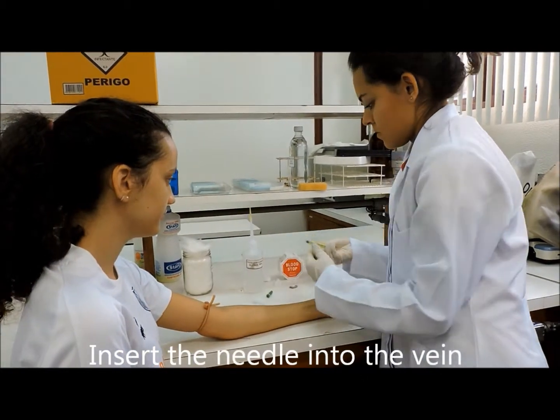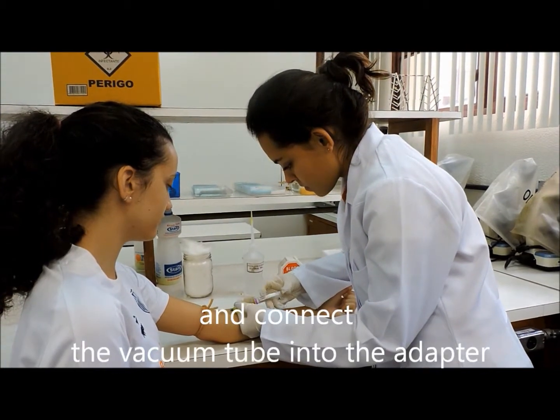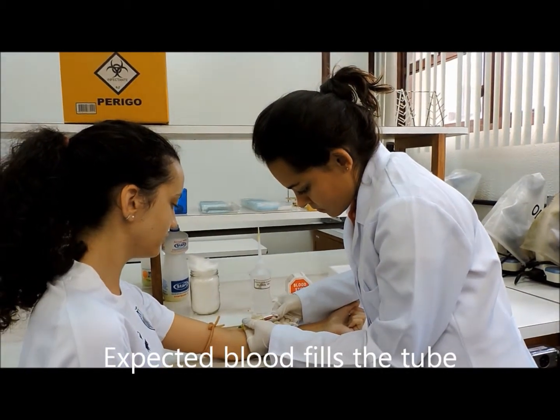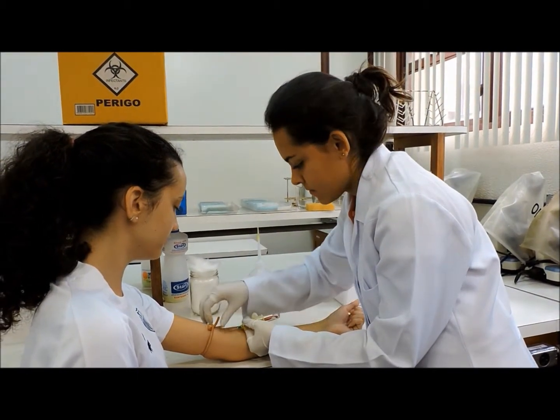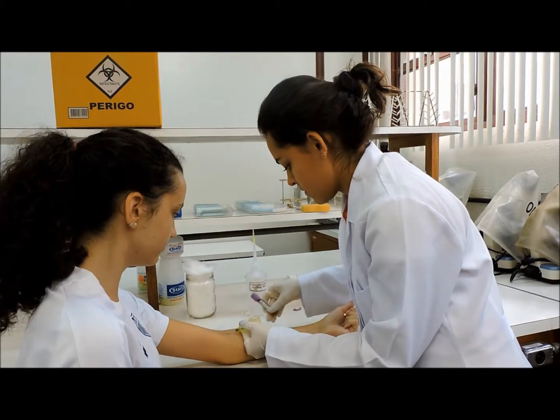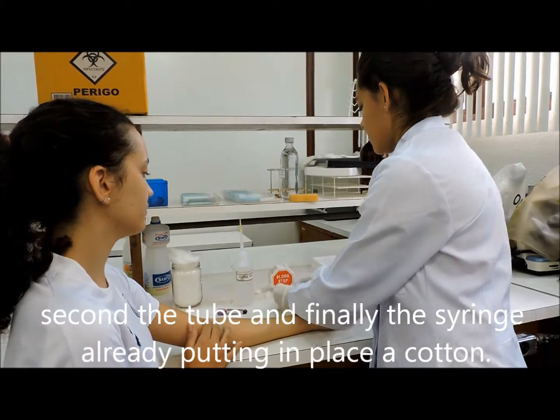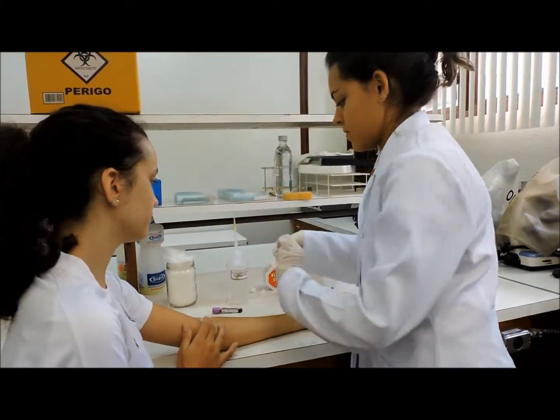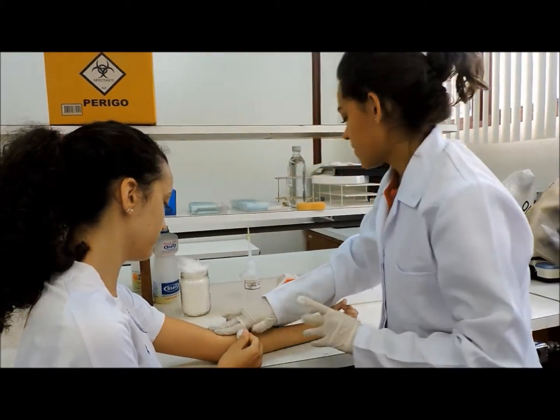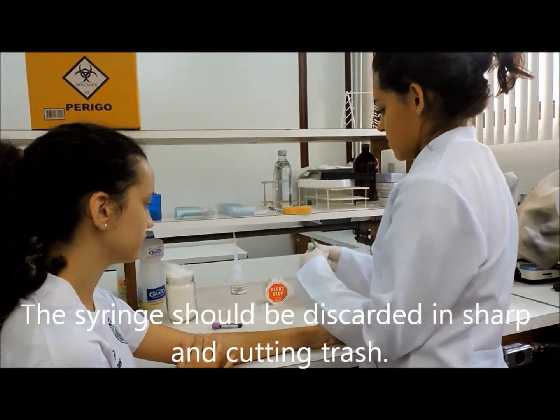Insert the needle into the vein and connect the vacuum tube to the adapter. Wait for the blood to fill the tube. After that, first the tourniquet is removed, second the tube, and finally the needle, already placing a cotton in its place. After some seconds, she removes the cotton and puts on the bandage. The needle should be discarded in the sharps trash.